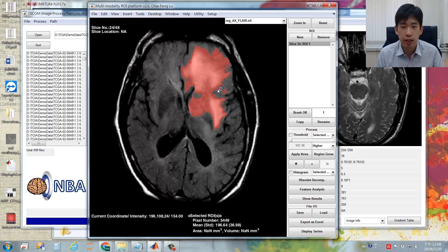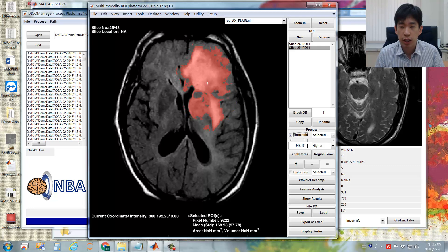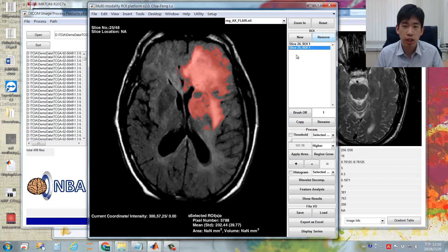Next, scroll to the next slice and press the New button to create a new ROI for that slice. Apply the same threshold value — make sure you use the same threshold value across different image slices. There is a more efficient way: first create all the ROIs across different slices, then select multiple ROIs using Shift.